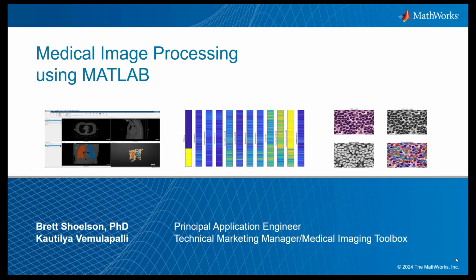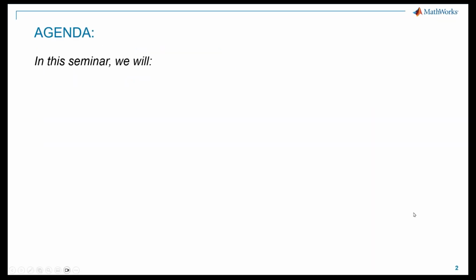Looking back, the things that were challenging or even impossible in the area of medical image processing 30 years ago are relatively easy today, in large part because of new capabilities that we've introduced through tools like the Medical Imaging Toolbox. So we're going to talk about medical image processing using MATLAB today.